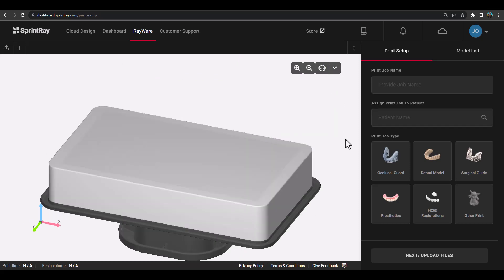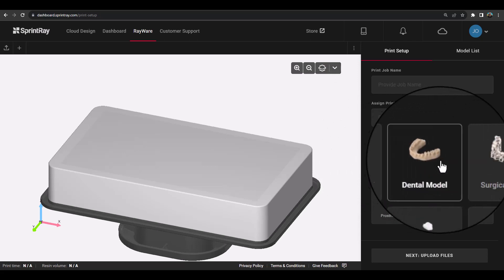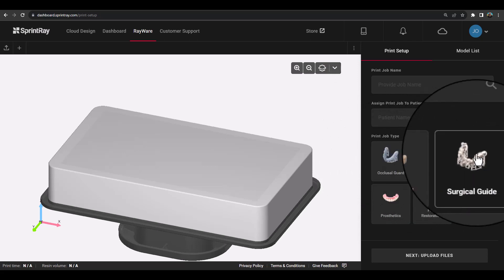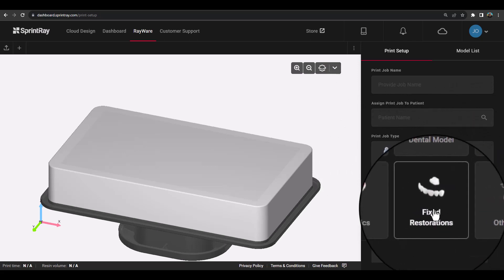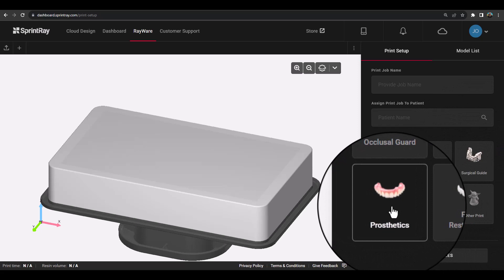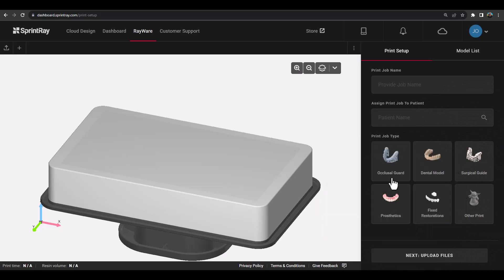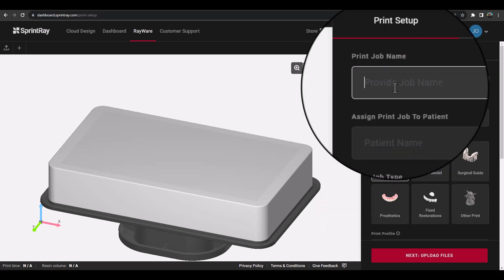Begin by making your appliance selection using the print job menu on the right-hand side. Depending on the appliance selected, Rayware features automations for print orientation, nesting, and supports to ensure the most efficient workflow for your chosen appliance type.